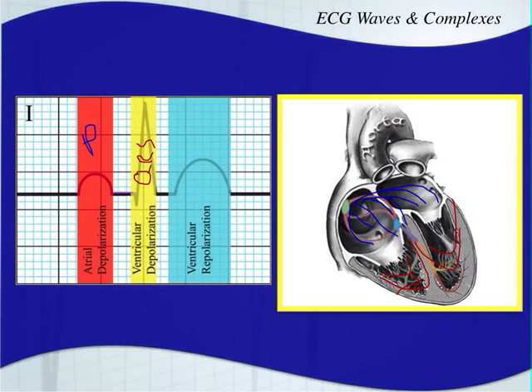Finally, when the ventricles recharge, that's repolarization. So when the ventricles are all recharging, I'm going to just kind of draw recharging like that, you get a T wave. Okay, so that final wave is the T wave.